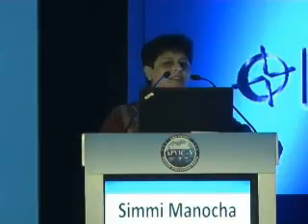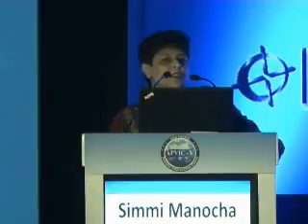The uses of the linear probe are, it is ideal for superficial structures. Vascular access can also be obtained, like central or peripheral lines can be put in using the linear probe. We can evaluate deep venous thrombosis. Arterial Dopplers are done with this probe. Skin, soft tissue structures, tendons, bones, muscles can also be identified with this probe.